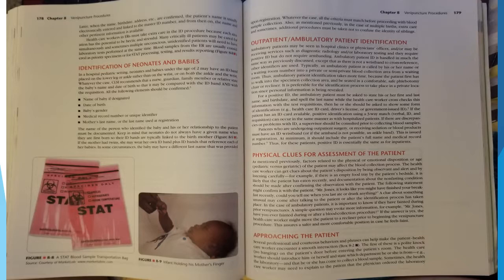Approaching a patient. Several professional and courteous behaviors and phrases can help make the patient-healthcare worker encounter a smooth interaction. The first of these is a polite knock, no banging, on the patient's door before entering the patient's room. The healthcare worker should introduce him or herself and state which department he or she is from, such as the laboratory, and that he or she has come to collect a blood sample.